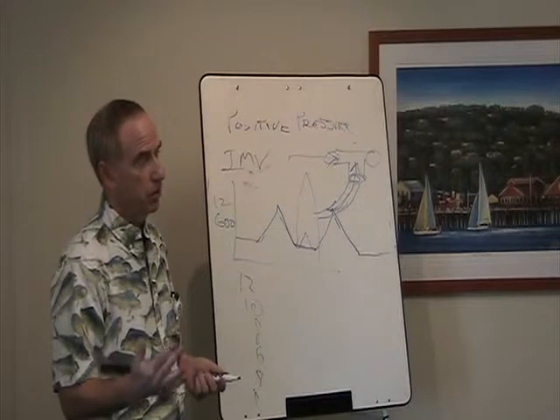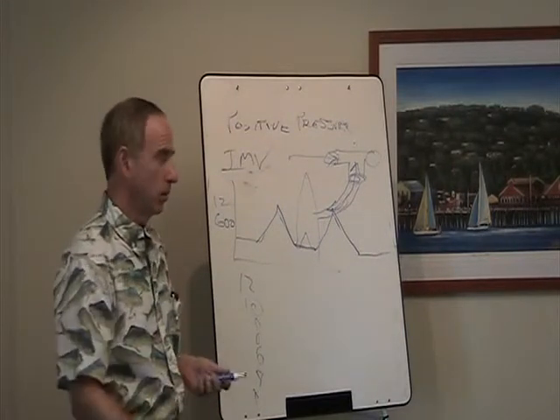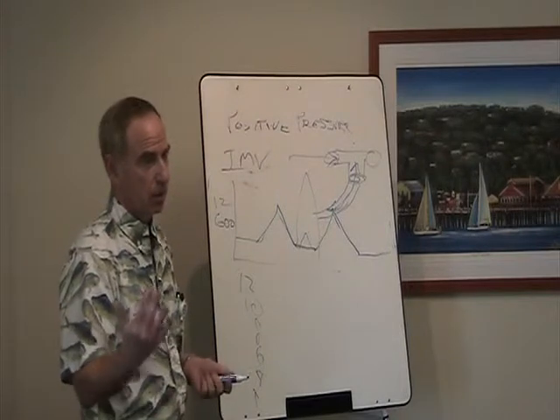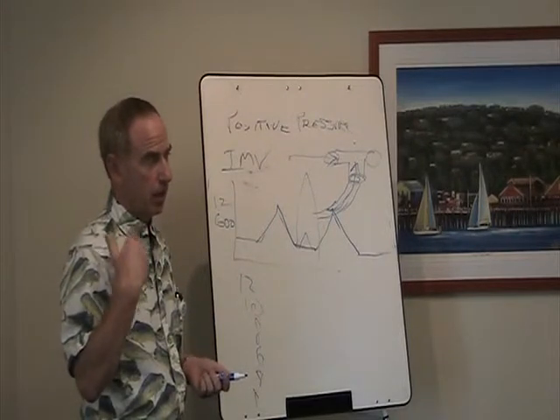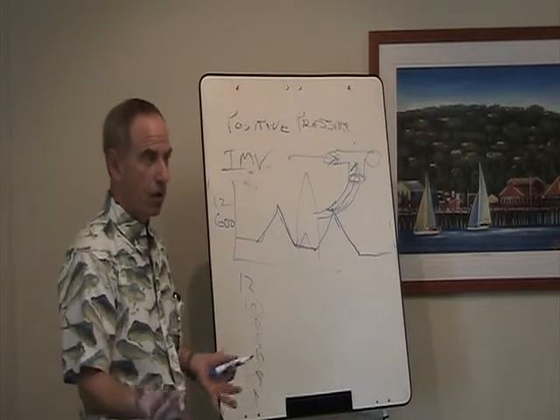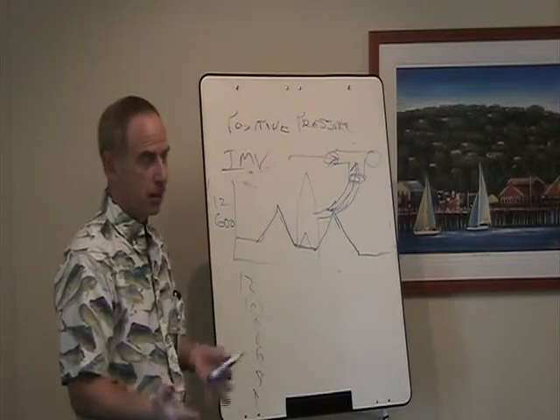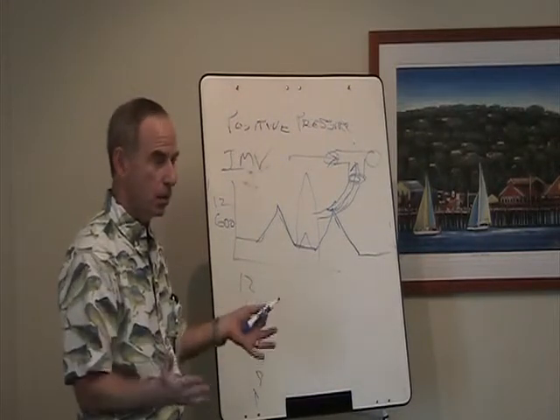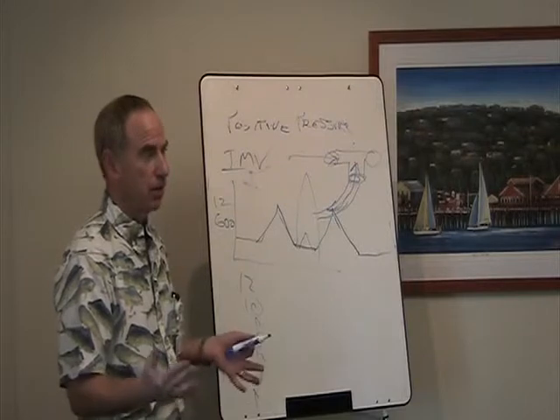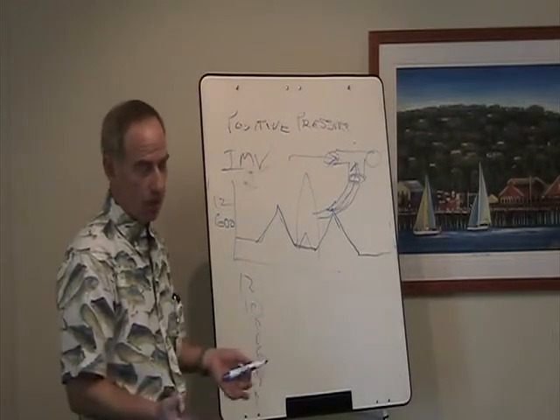And still, there's this bias or feeling amongst older respiratory therapists and nurses. When you say, well, I think the patient is ready to start weaning, and they're on assist control, they always want to move to IMV. Well, can we move to IMV now? Because that was kind of the way it used to be done years ago. If you started out on assist control, you'd go to IMV and then wean them that way.